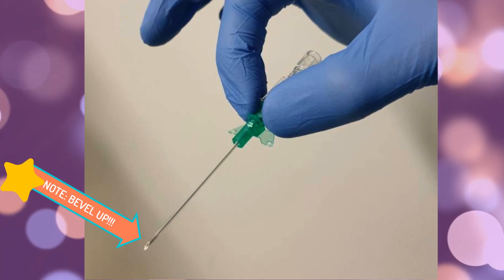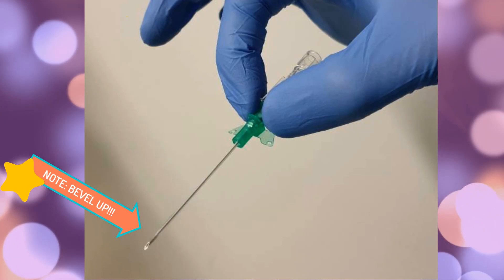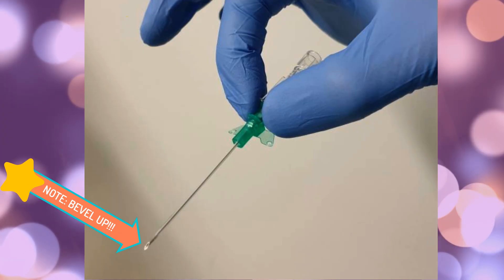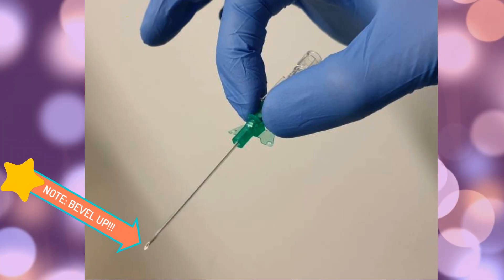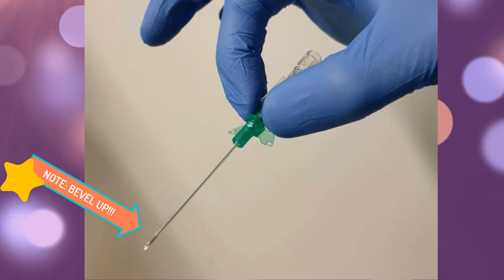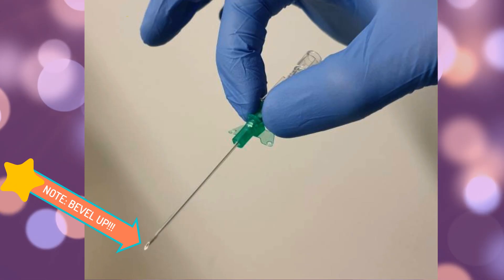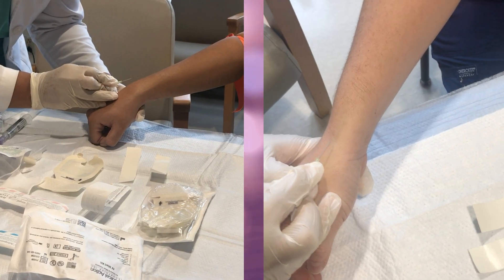Once you have chosen the gauge of needle to use, make sure when inserting the needle that the bevel is up — this is what the bevel looks like. You may ask why the bevel has to be up and not down: when the bevel is up, it allows the sharp tip to pierce the skin first, paving the way for the rest of the needle. If the bevel is down, it will cause painful tearing of the skin.